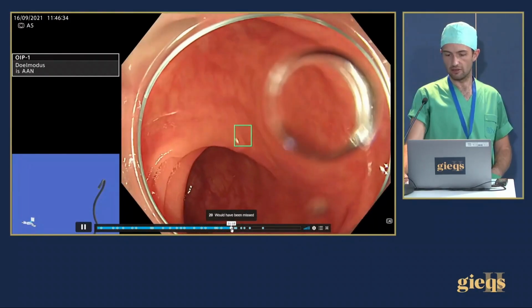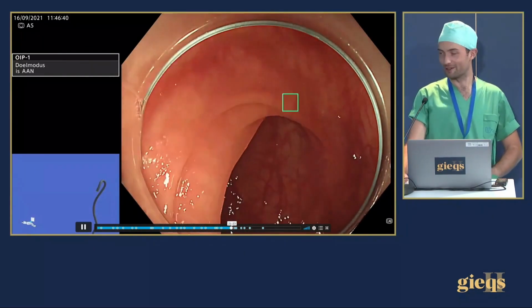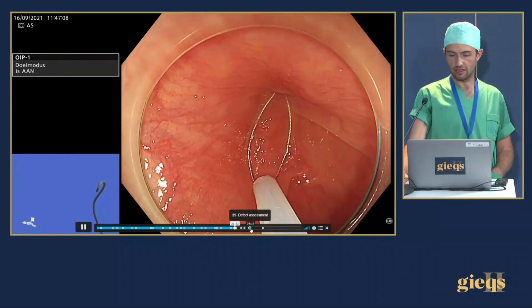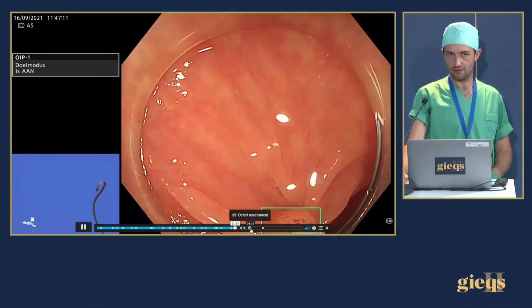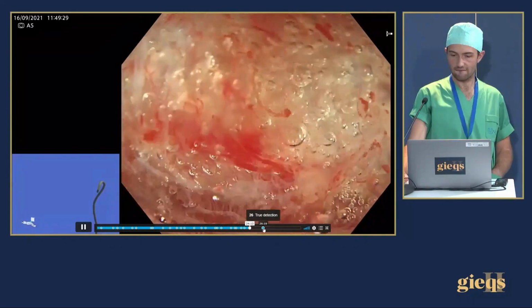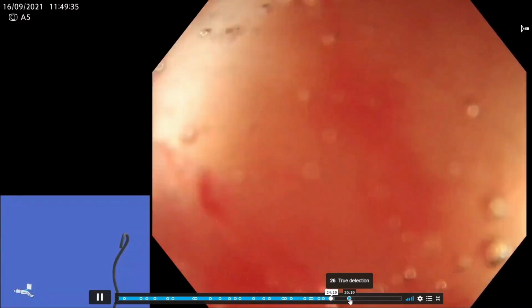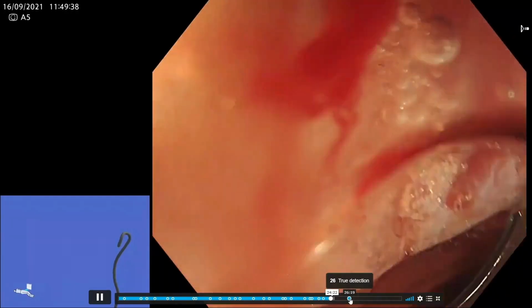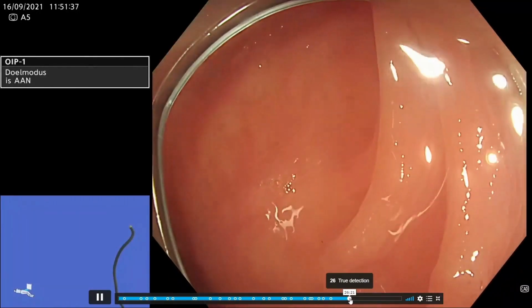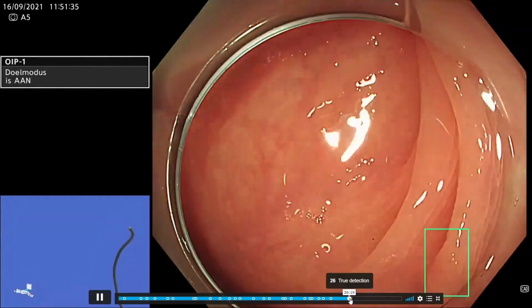And then you suddenly zoom in on it, and it's just embarrassingly clearly an adenoma, right, when you go up to it, and then you can characterize it and see it further. So I think you can make the point that that is the role. Raf, do you see that as the role, or do you see it differently? No, absolutely. I think that's how it works. And the fact that you sometimes get a false positive isn't a negative aspect of these techniques. On the contrary, it just focuses you on these areas that you need to focus on, and by showing these things you need to look at, the system also trains you to look automatically, even if it's nothing. And like you say, if you miss something and you have a box, you go back and have a closer look.